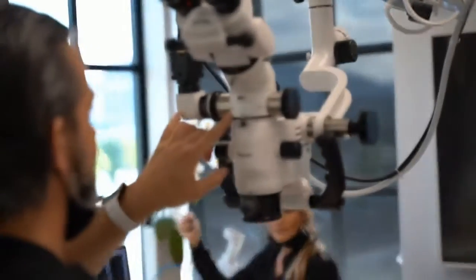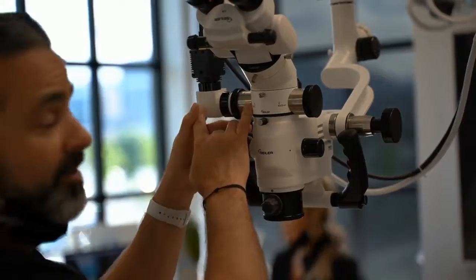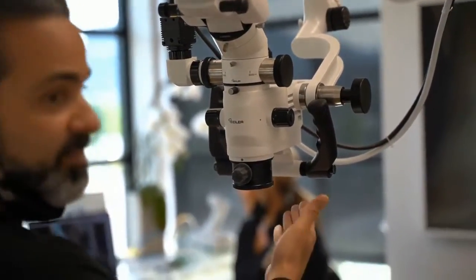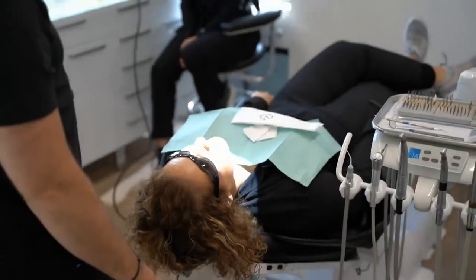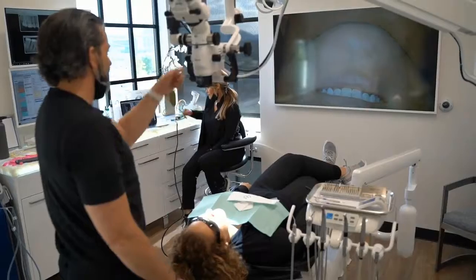So this distance is not as affected because of this correction. It gives me the ability to have this extreme distance between me and the patient. Look at that distance, we've got like 2.5 feet here. There you go. And I'm in focus.